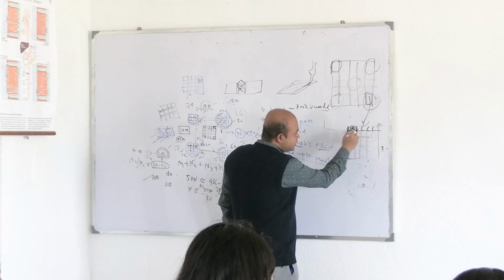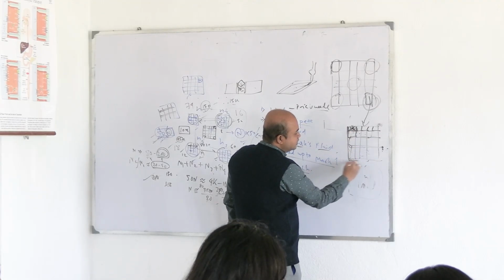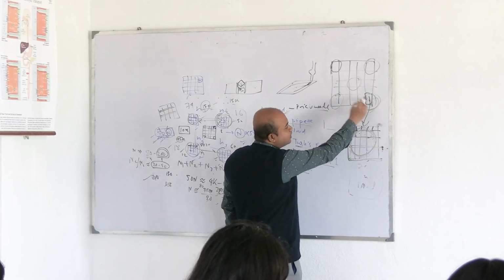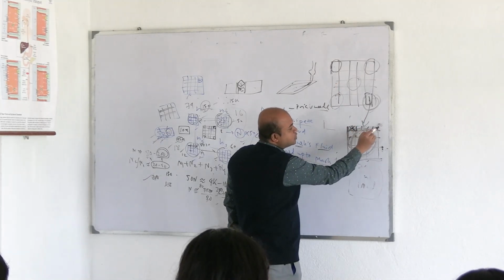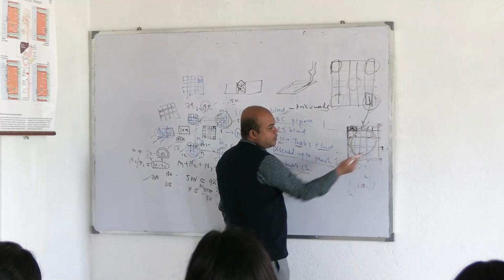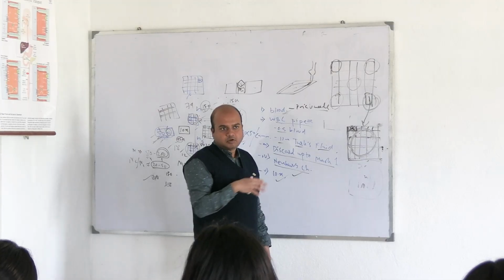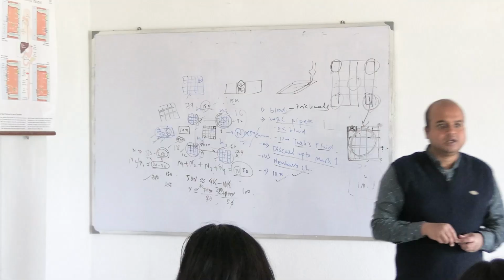This square plus this margin and this margin. After all this is completed, what happens? This is complete and all the central part is complete. This is the whole, say the right lower or the left upper. So this is complete. Now count on these margins. So this is complete counting of one such medium square. Cells here we are referring to the blood cells, so don't call the squares cells or you will confuse. Cells are the blood cells, squares are the squares.